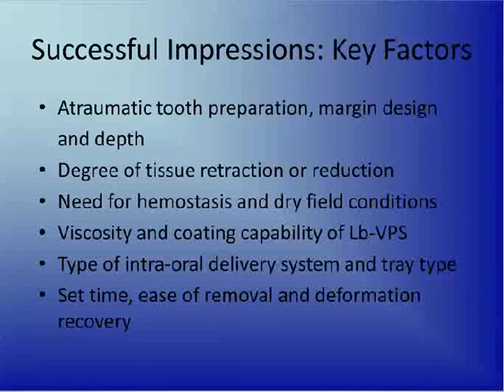We have to have a heavy body which acts as a support mechanism, does not displace the light body cervical injected portion of it, and has adequate working time and coordination, such that as soon as we're done with the use of the light body and the working time, the heavy body's there ready to be inserted.